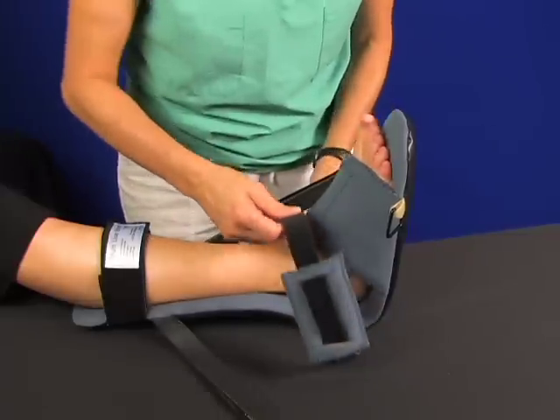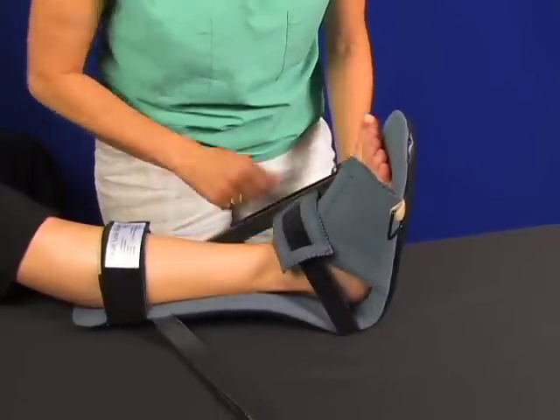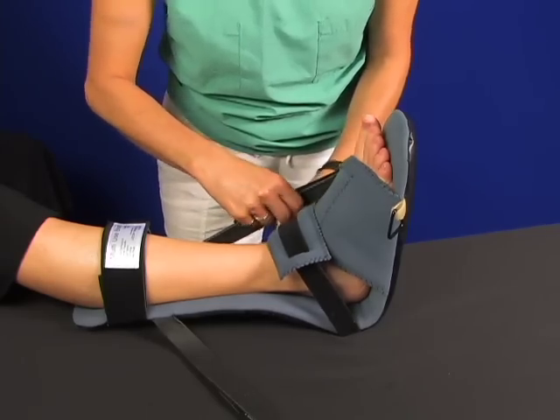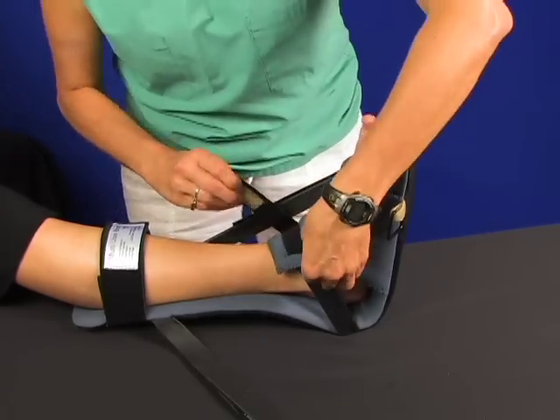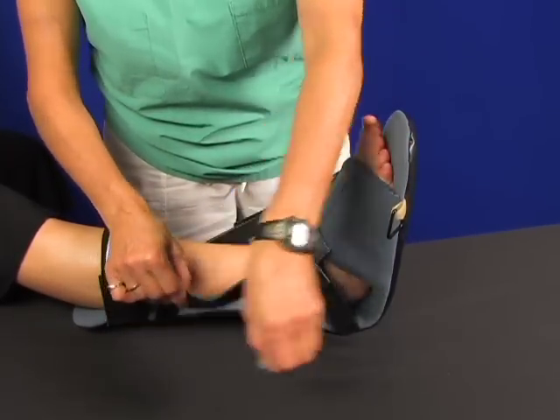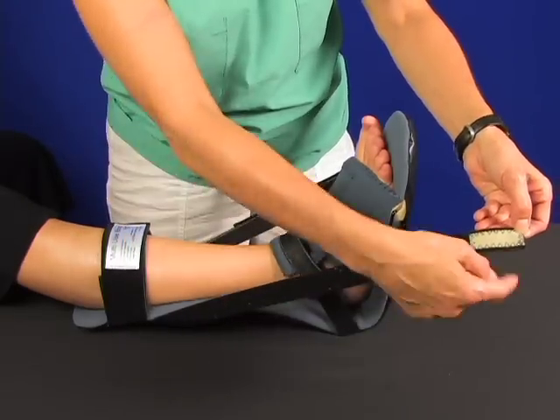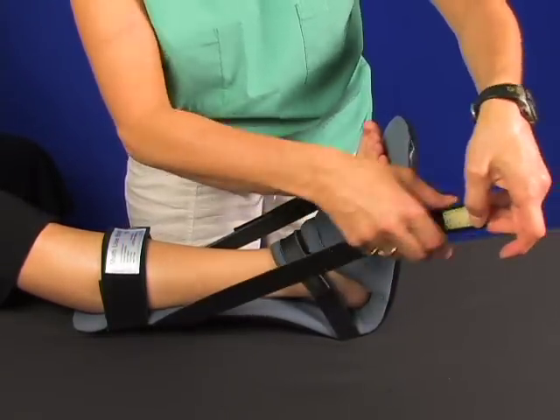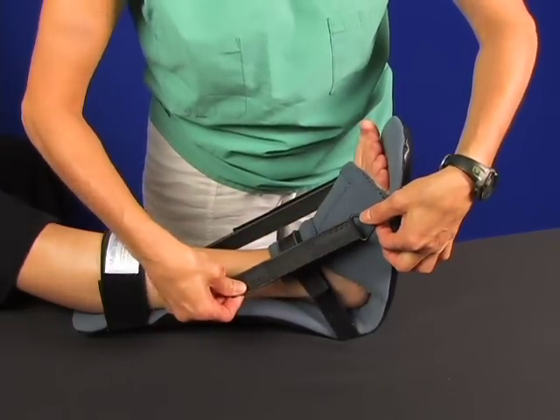Now, reapply the instep strap. Carefully adjust this strap. Center the pad on top of the instep. The instep strap is required to pull the heel back into the boot and counteract foot drop. Now reapply the side strap by threading it through the slot on the foot and hooking it back on itself.